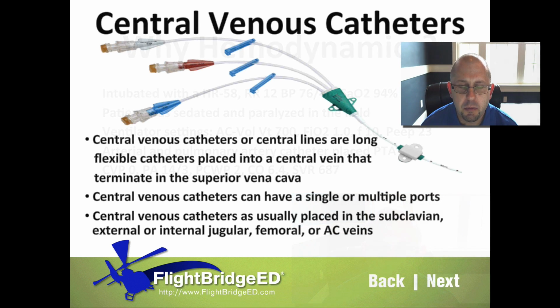Central venous catheters are placed all the time. They're placed for different reasons. Different physicians will place them, and then I see other physicians that will stay away from them. But the point of a central venous catheter is to get a good access point where they can infuse medications. They know they're not going to have any issues with infiltration, movement, and things like that.